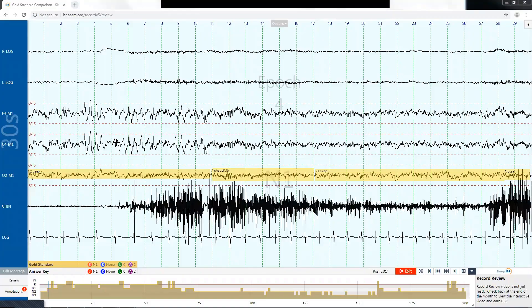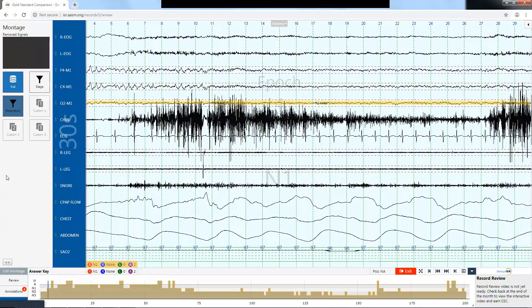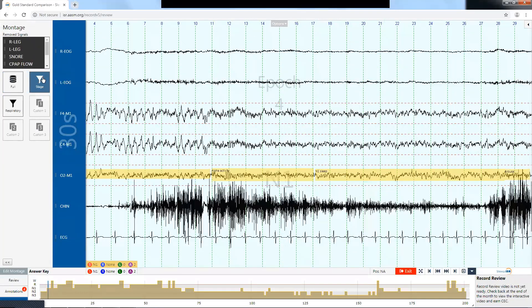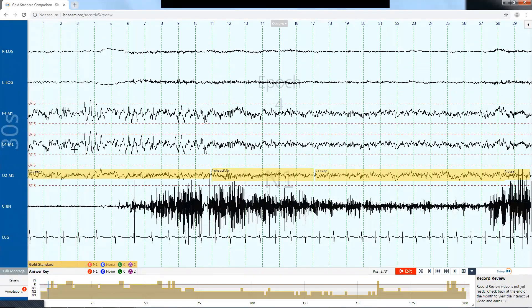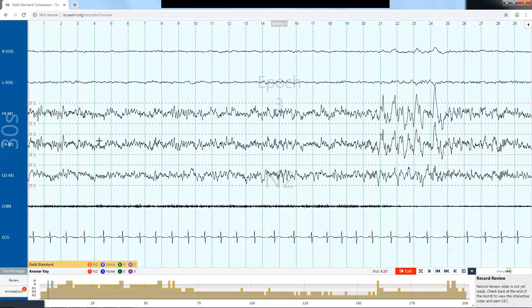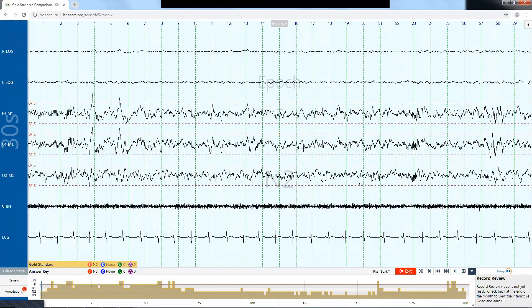I want to show you what the different montages look like. With the full montage you can see all the different channels. With the staging montage the EEG channels are much more clear. When we look at the first epoch of this record, we can see K-complexes and spindles, so this is clearly N2 sleep.